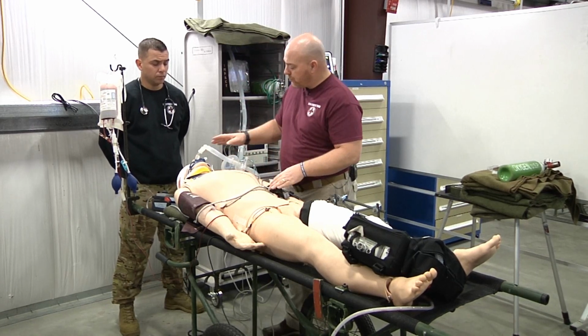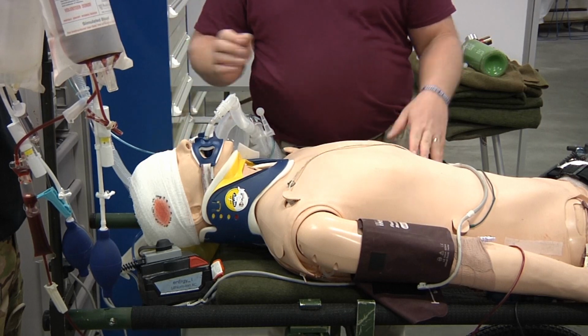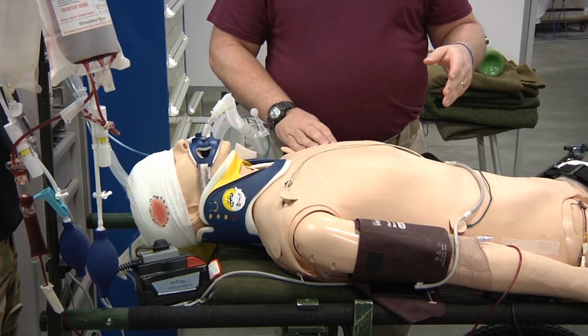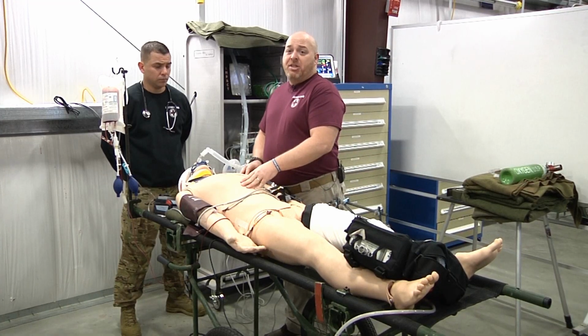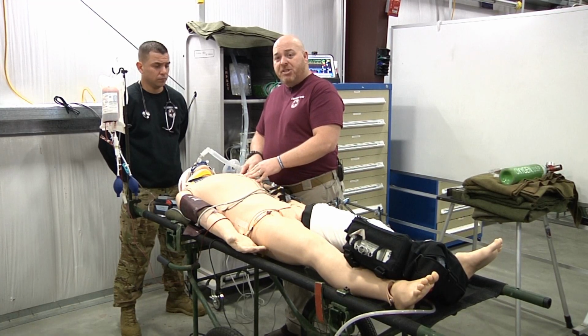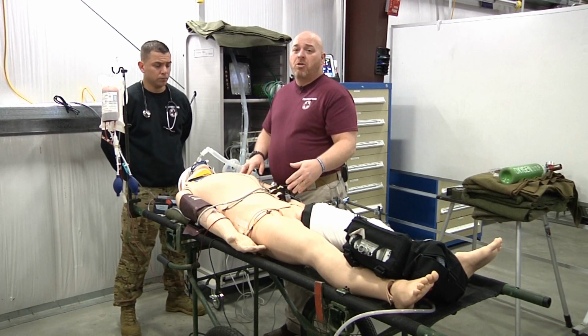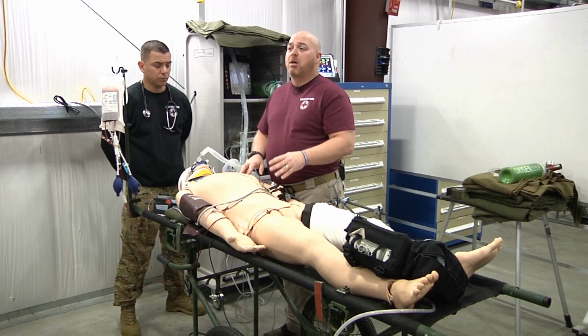Okay. So we've checked for compliance. We've auscultated our heart and lung sounds. All right. Now's a good time to request an ABG. If you haven't already requested an ABG, you can look at the previous ABG, but we're about to put them on the vent. We want to know if the ventilation has been working appropriately.